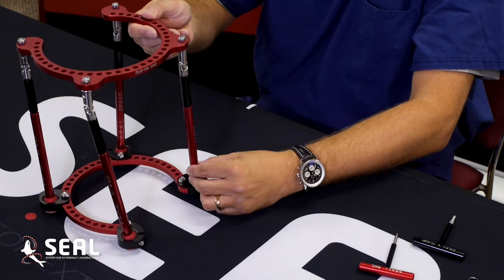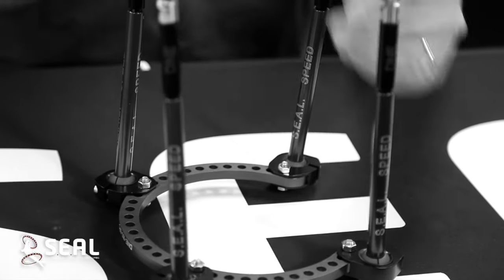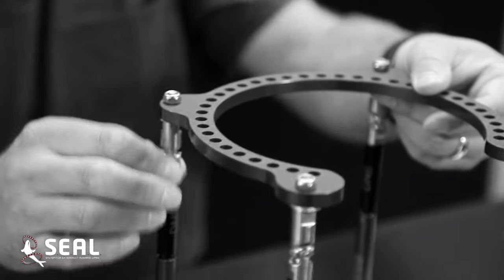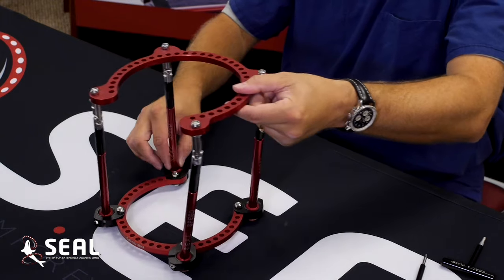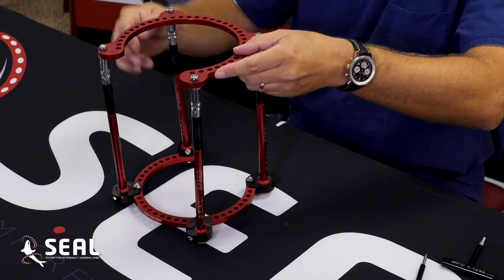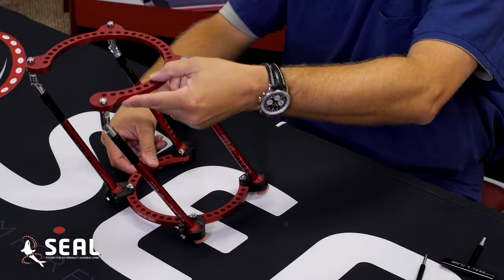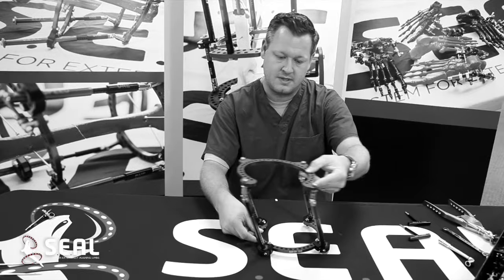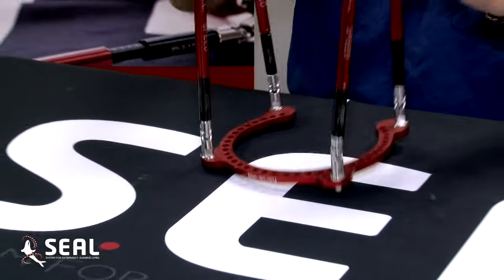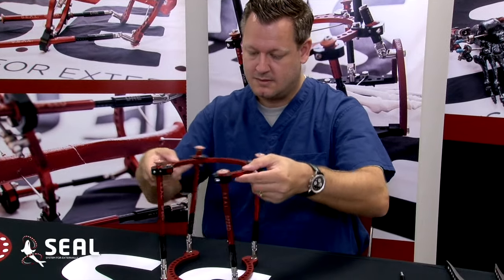For example, we have our universal struts that have an option of different styles of conformity to your anatomy and pathology. The struts up top with the angular fixation bend almost to 90 degrees, with the bottom hinge ball joints roughly 45 to 60 degrees. As you can see, the frame comes vertical. You can loosen all your bolt apparatus, and you have a high degree of angular correction with initial assessment to the patho-anatomy and then correction of the anatomy which you'll reduce it to. All three cardinal planes are addressed within this frame.